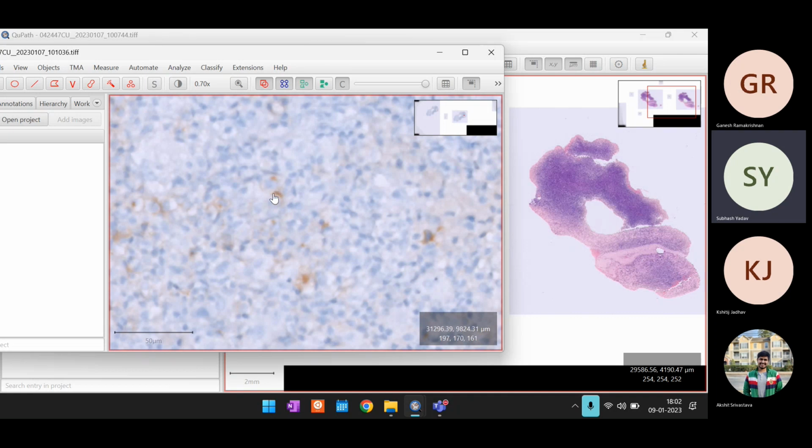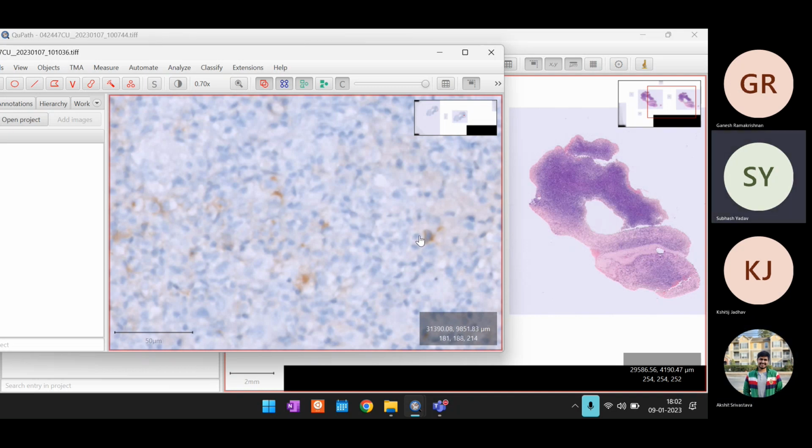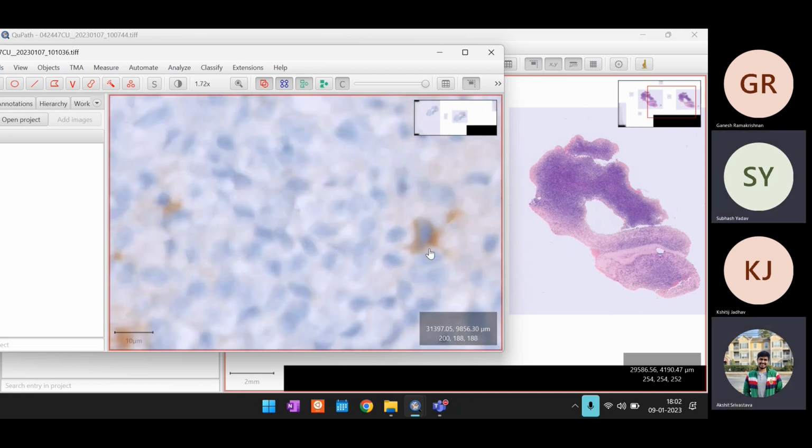So it will always be a cytoplasm or a cytoplasmic membrane type. The nucleus should be negative. And even the only cell on the right side, at 3 o'clock, if you zoom in, you see the inside is still blue. So this is an RS cell. If you compare the size to the adjacent cell, this is quite big, so this makes sense. On IHC, it is the cytoplasmic brown color, the cytoplasmic staining, that it takes.